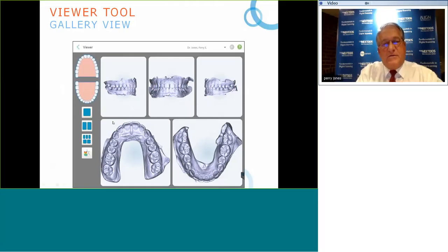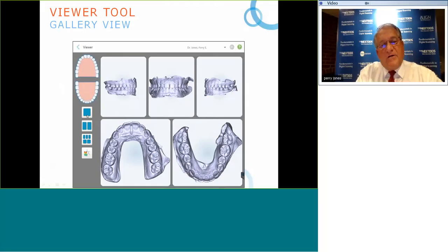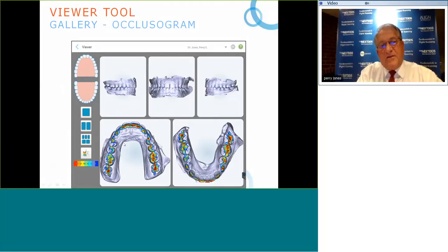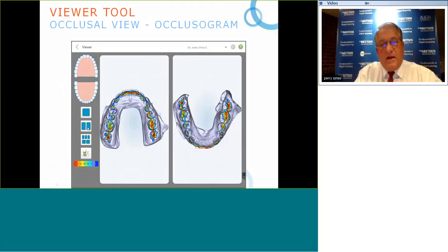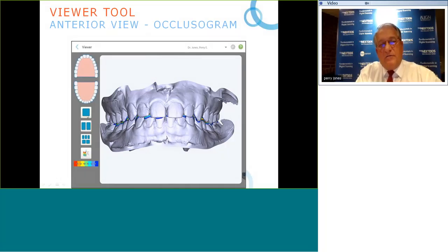On the restorative side, there are tools to view different images of models — a gallery with buccal anterior, buccal occlusal, and occlusal views. We can put two images side by side — for example, a highly accurate occlusal rendering showing the amount of contact between teeth in maximum intercuspation — or view as a single solid image with a color pattern indicating the relative amount of occlusion.